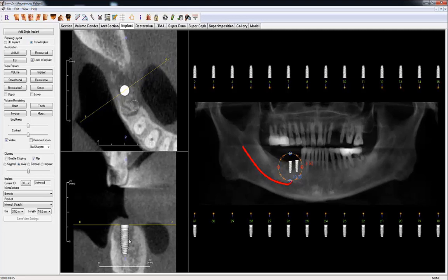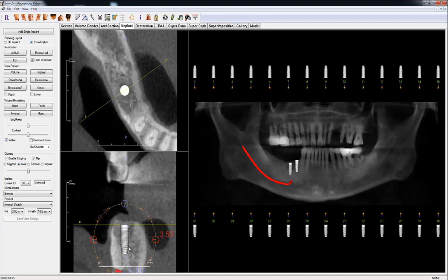The bottom window shows the plane of the yellow AB line, which should display the buccal-lingual cross-section. Similar to the 3D implant view, you can set the Manufacturer, Product, Diameter, and Length in the View Control for the selected implant. In the panel and cross-section view, the same widget will appear to adjust the angle, length, and diameter.